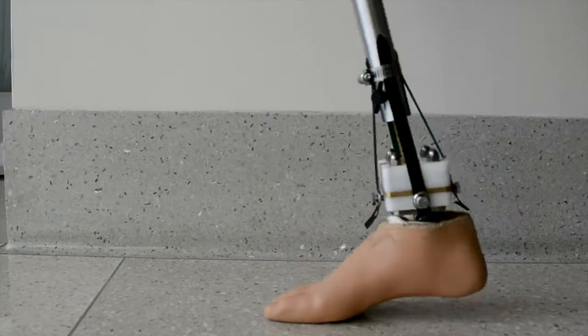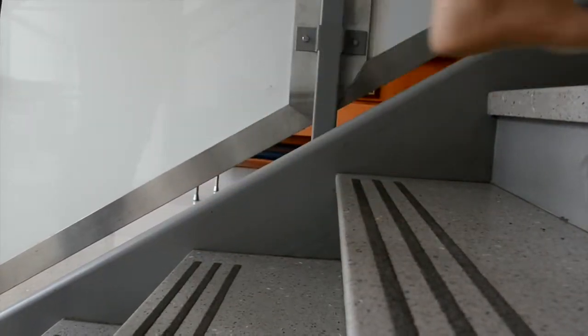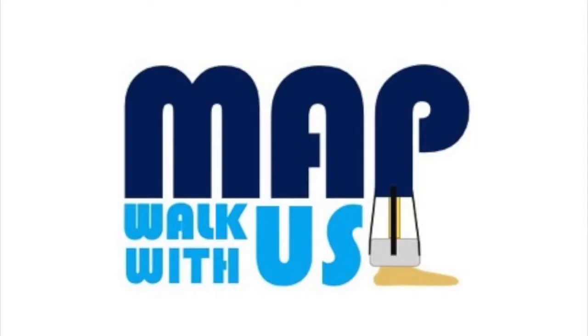The MAP ankle provides an accessible and affordable multi-axis prosthetic that can help lower limb amputees in developing countries regain their independence. The MAP ankle — walk with us.